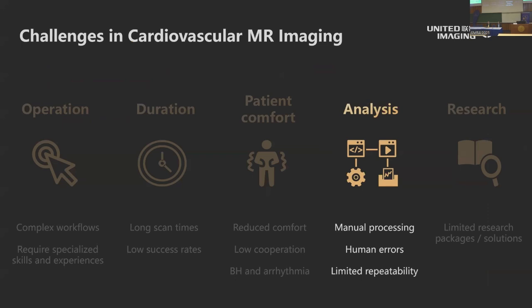All right, so next, let's take a look at the analysis portion. Acquiring very good data is only half the work. The other half is on how to extract useful information from those hundreds and thousands of cardiac images. And the challenge lies in how to do it effectively and reliably.